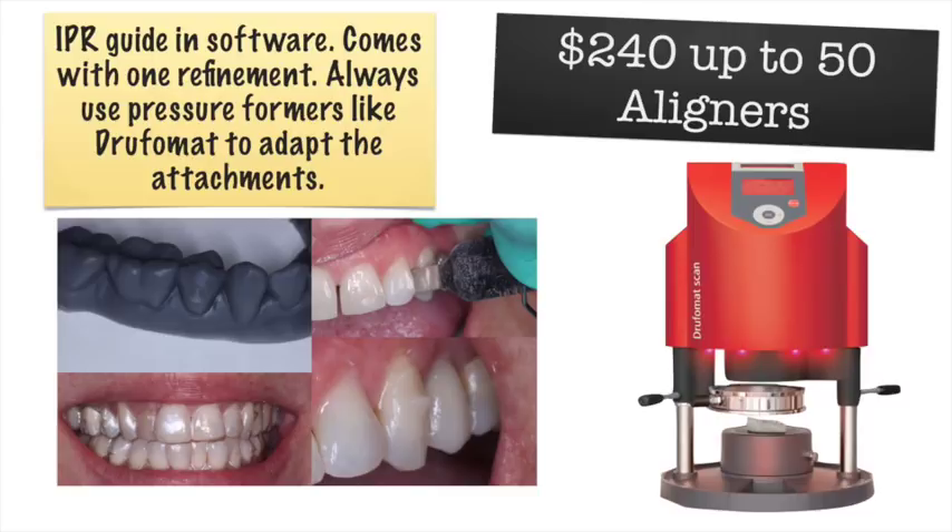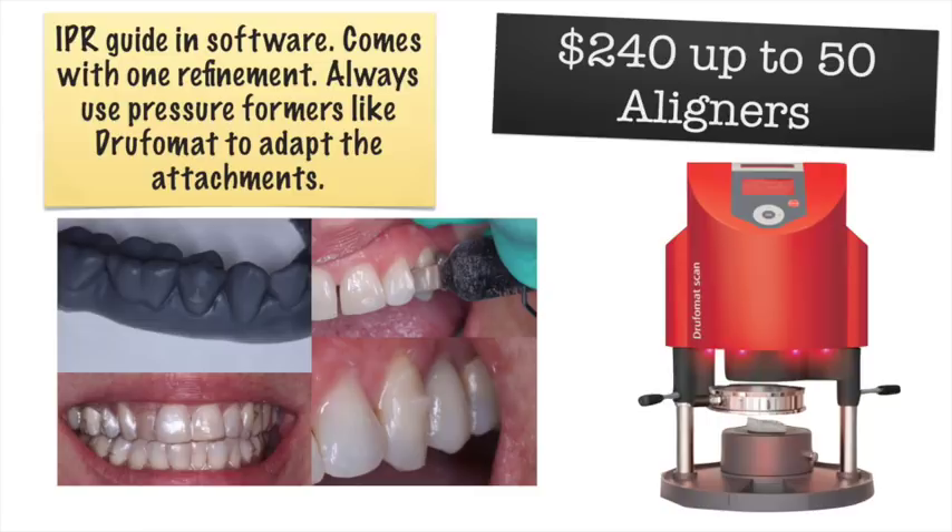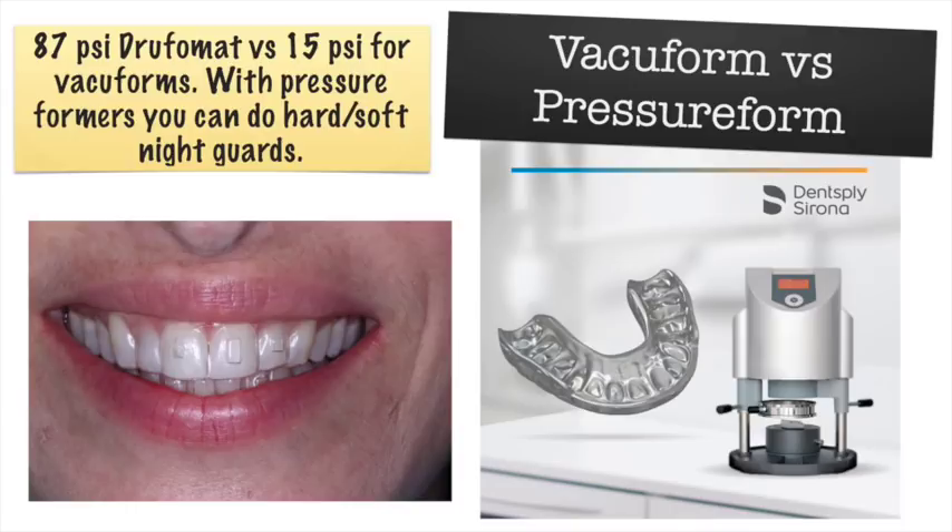You can see the detail we get — this model was printed on the Form 2 printer. We want to use a pressure former because we really need to capture the details. A pressure former exerts pressure from below like a vacuum former, but also on top. If you vacuum-form these, you get a rounded-off attachment, and with attachments we're directing force against a flat plane so we need to capture those details. The Drufomat exerts 87 pounds per square inch, versus a garden-variety vacuum former at about 15 PSI — the attachments come out really crisp and square.